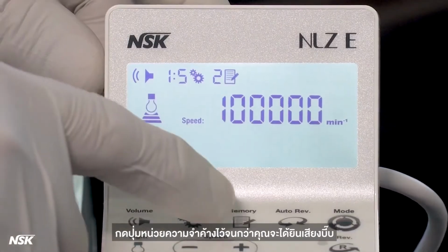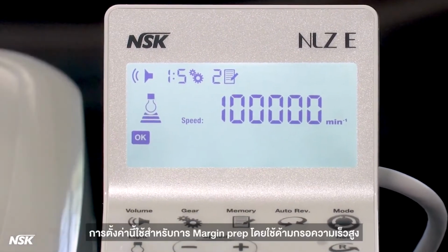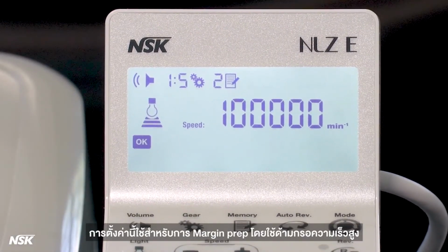Press and hold the memory button until you hear a beep. Now, the setting is stored as program number 2. This setting is used for margin prep using a high-speed attachment.